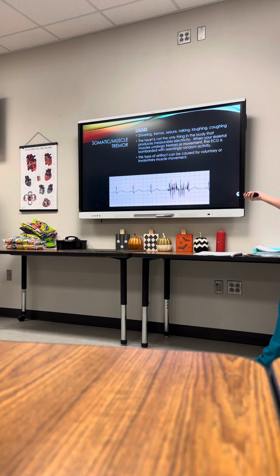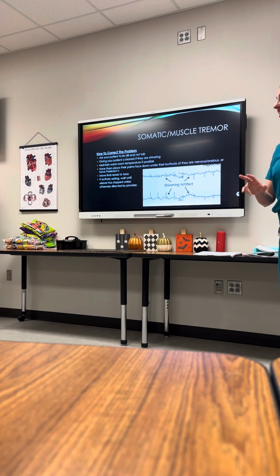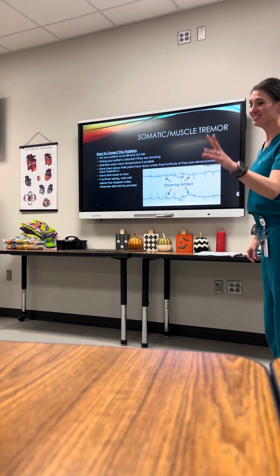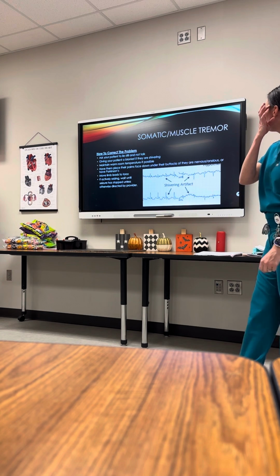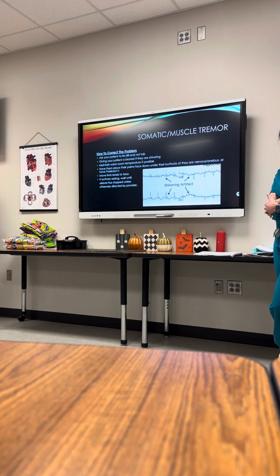Okay, so how do we fix it? Here are some ways that we can help with somatic artifact. Ask our patient to lie still and not to talk. Not Luke's method. Don't yell at him. Gently encourage. Give your patient a blanket. You've seen the warm blankets in the hospital, haven't you? You can go get them a warm blanket to help if they're cold. Keep the room at a warm temperature if possible.